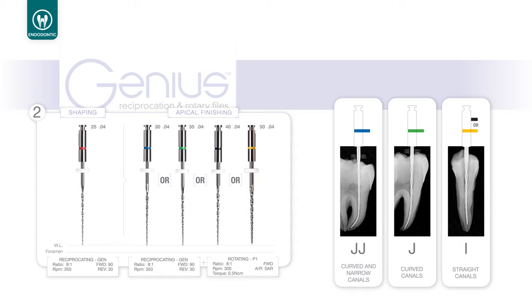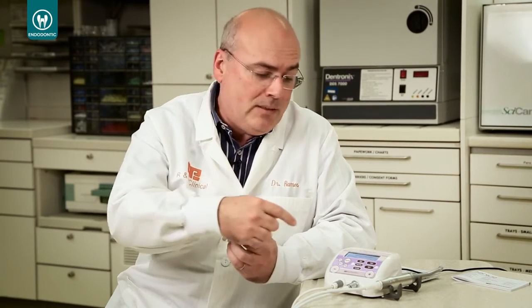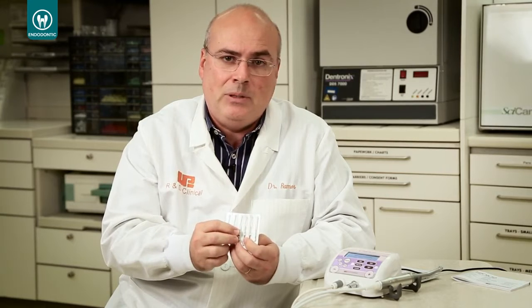Let's say that you are doing a premolar. Then you can use a 40. Or even larger canals, you can use a 50. So the last file will depend on the anatomy that you have, on the morphology and the directions of the canal. Plus, you are going to use reciprocation again until the working length. And then you press the mode button on the Genius motor, and in rotation, just to remove debris, you can finish your instrumentation. Now I want to show you the sequence of the Genius files in acrylic block.